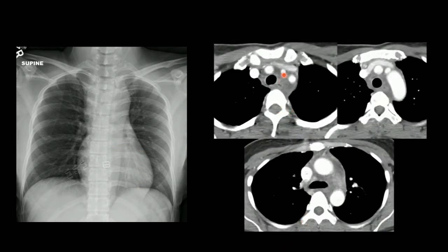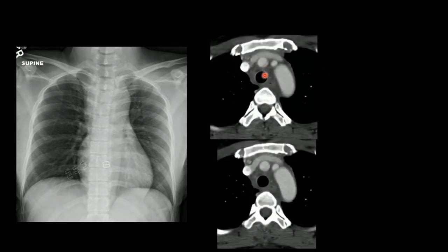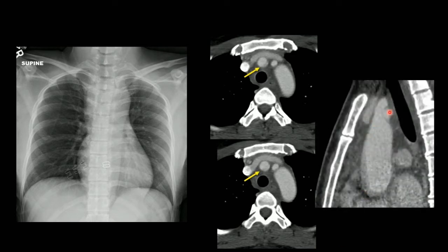Another easy miss: This patient said they were in their garage and the door of their car closed on their arm, and they were dragged for like 10 feet. They got this radiograph, which is not normal. We've got a widened superior mediastinum, high attenuation extending over the left thoracic apex, so-called left apical capping. On CT, there is blood touching the aorta and great vessels. If you don't window it down, you might miss the subtle contour deformity in the brachiocephalic artery. Multi-planar reconstructions show a focal outpouching, confirming great vessel injury. This patient was managed with aspirin.